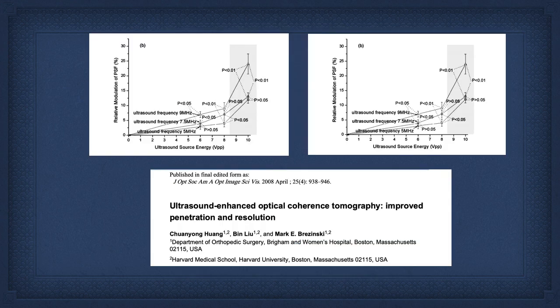Now, what was exciting, this was their second paper, published in the Journal of the Optical Society of America, on OCT with ultrasound, is that it works by something like the photoelectric effect. I do not expect you to understand the graphs above. The only thing I want you to understand is that they're not linear.